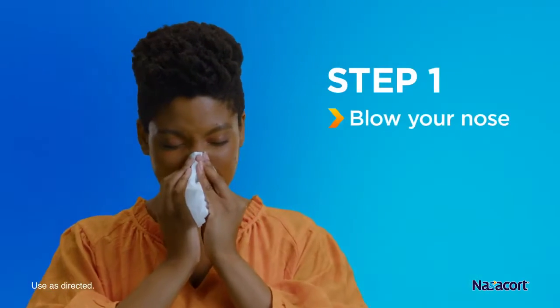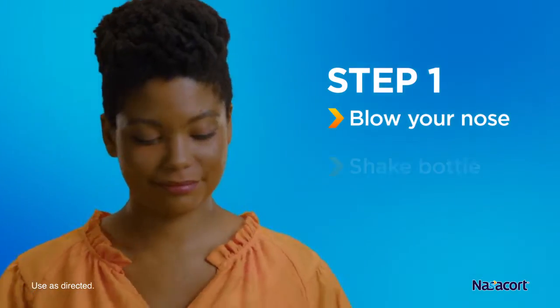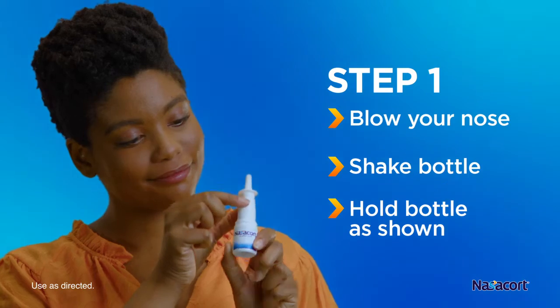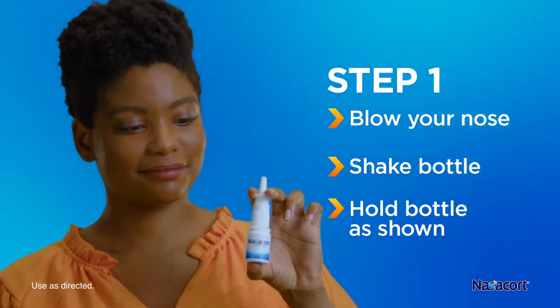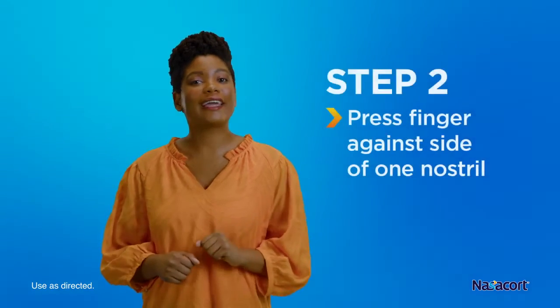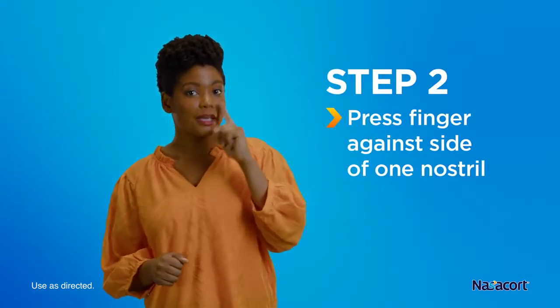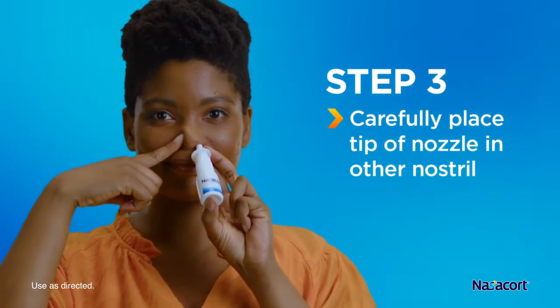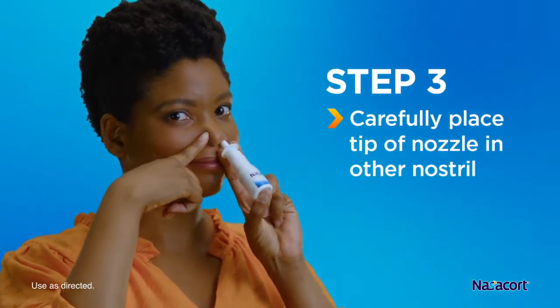First, blow your nose to clear out your nostrils. Next, remove the cap, shake the bottle, then hold it with your thumb underneath the bottle and the spray nozzle between your fingers. Then press your finger against the outside of your nose to close off one nostril. Place the tip of the Nasacort spray nozzle in your other nostril, making sure it doesn't reach far into the nose.